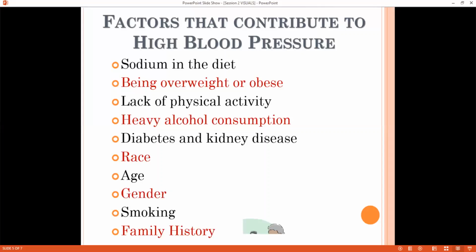If you turn to page 8 in your workbook, it's how is blood pressure measured? So blood pressure measurement is quick and painless and doesn't require any blood to be taken. When we measure blood pressure with an instrument called a blood pressure monitor, it typically has 3 parts: the cuff, a pump attached to the cuff by a tube, and a dial or screen that is also attached to the cuff by a tube.